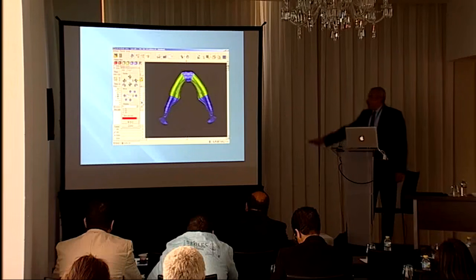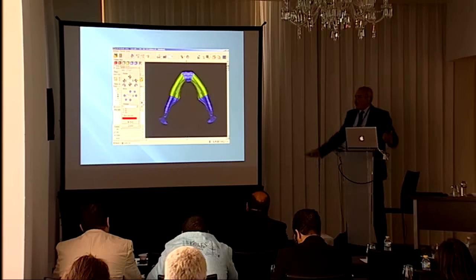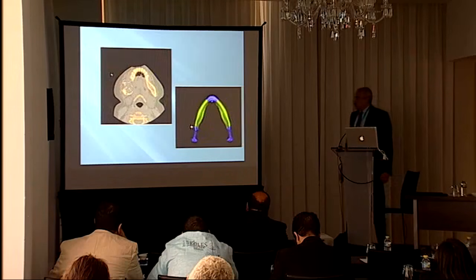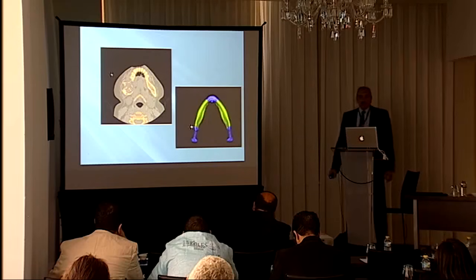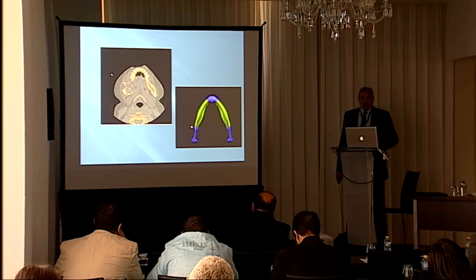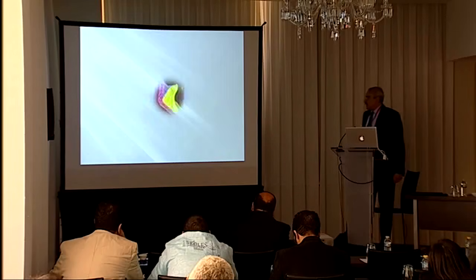After that, we take the other part of the mandible from the other side, we do what we call mirror imaging, and we place it in place of the resected piece. So we restore the mandible to an exact symmetry, the right side to the left side. And we can do that as long as we did not cross the midline. And even if we cross the midline, we're developing the necessary techniques to do that, even if the original lesion was crossing the midline.